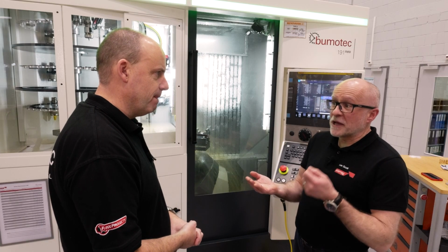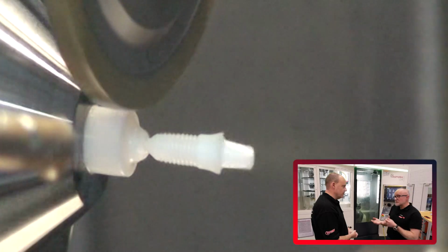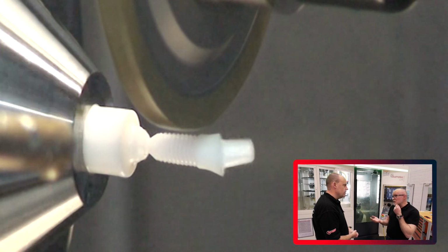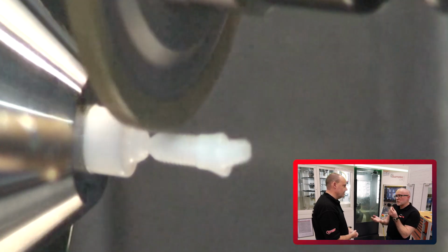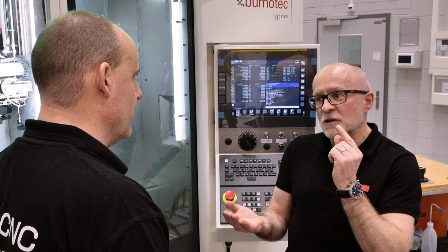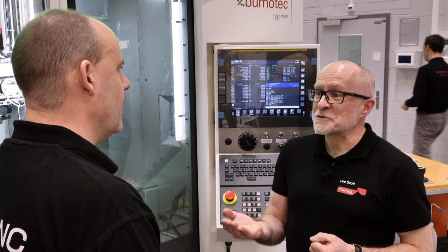So first of all, you have the implant. The implant is a very similar looking device, but with a thread on it, if you like. So the dentist will drill your jaw, screw this implant into your jaw, then sit the abutment on the top. What the abutment does then is it rotates and changes the angle of the top of the tooth, if you like, and then they'll just screw them all together.